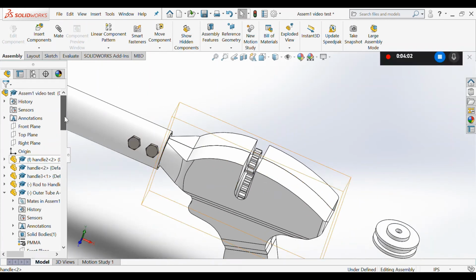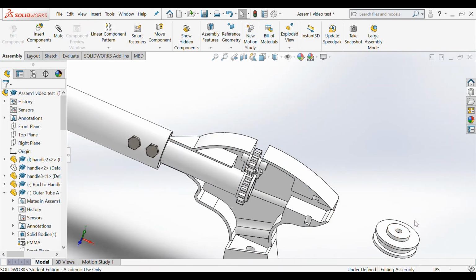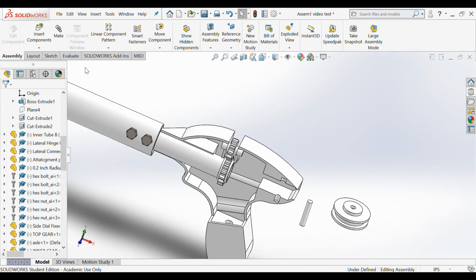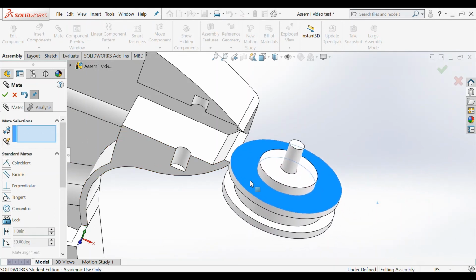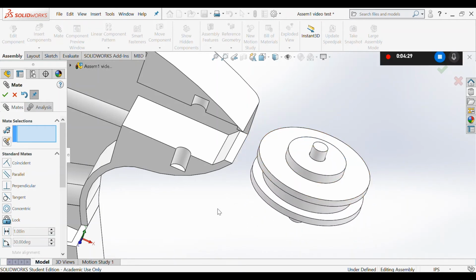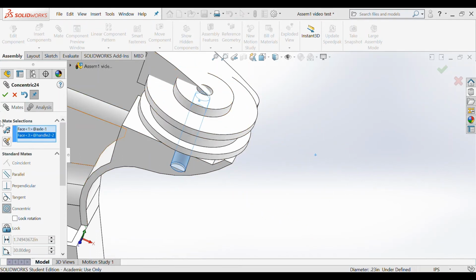I'm going to make that piece of the handle visible once again to insert this side dial. Next, I'm going to make the axle concentric to the side dial's hole. So I'm going to click that check mark. As you can see, you can move it around, but they still are connected. Next, I'm going to choose the outer surface of the axle and the surface in the handle. I'm going to make them concentric.